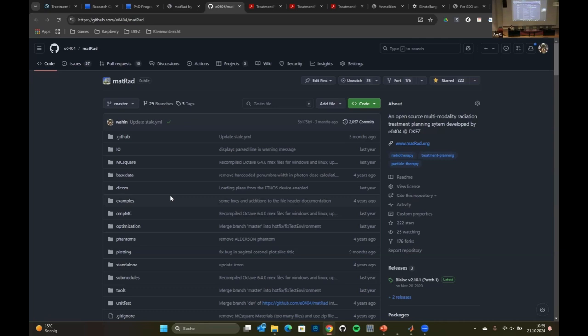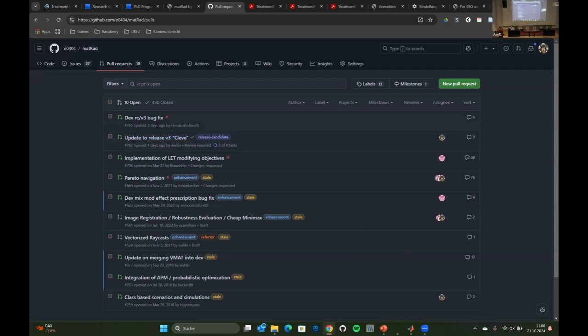There is something like a funding hell in research. So we had funding to create the software. It was created, and then it took a while to get the next funding. So there was a phase of 2 years now where we didn't really have a release, but a lot of research. And now we had some funding to get this back together, with some dedicated postdoc.